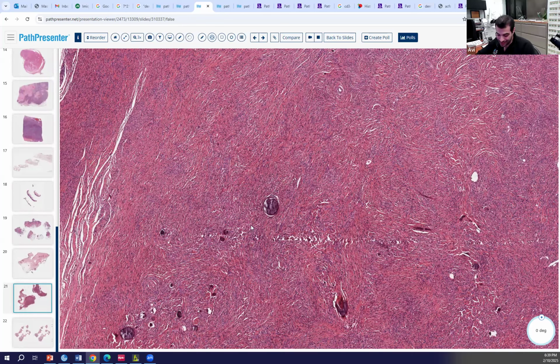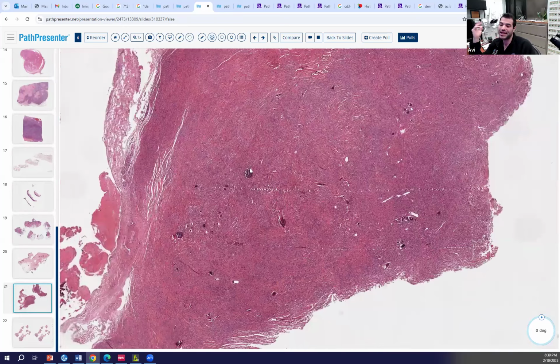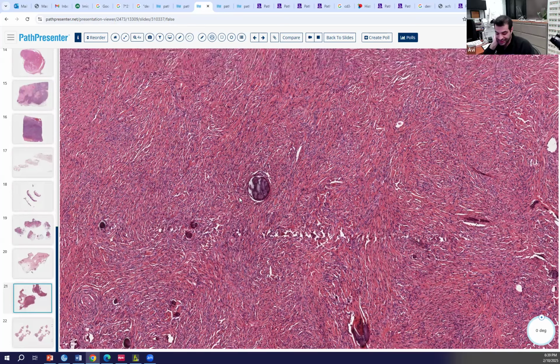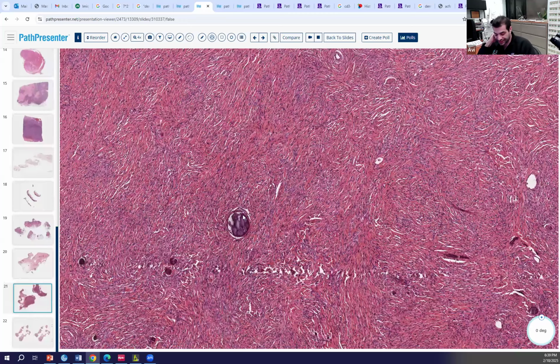Yeah, so you're not going to be tested on it, so I don't even know if it's worth it. But there's a type of ovarian cancer that can do psammoma bodies. But okay, yes, you picked up on the psammoma bodies. Very good. So in this case, what do you think this is? Rudimentary meningocele. Yeah, meningocele. So not papillary thyroid cancer, not serous carcinoma of the ovary.